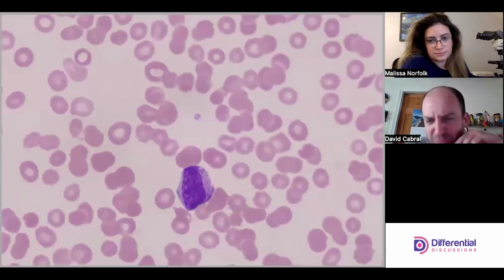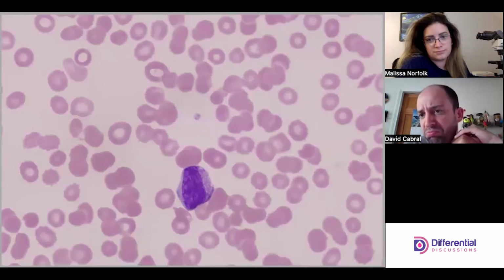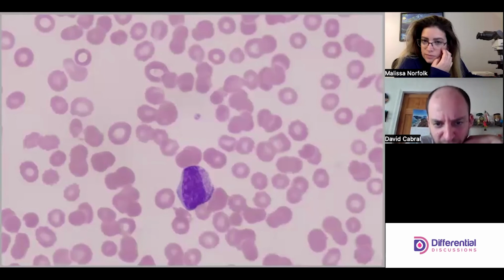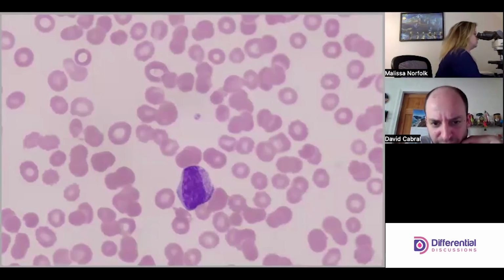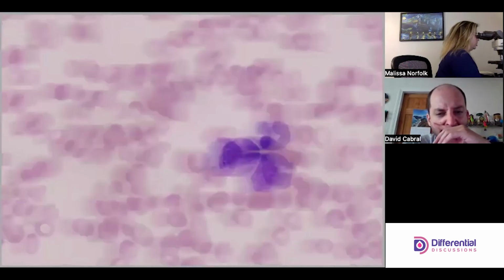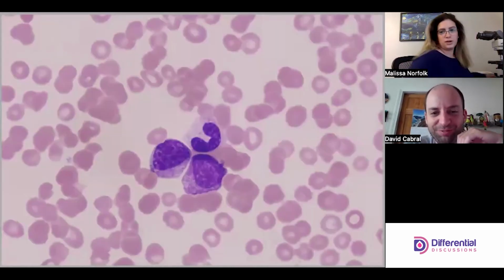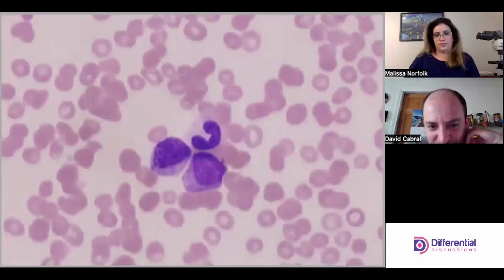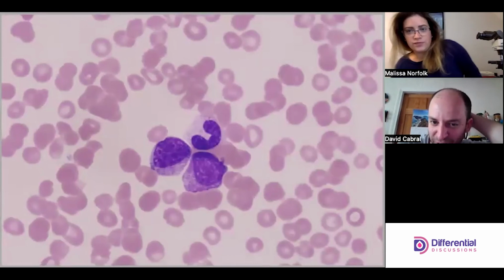Pro? Yeah. The granules are not as prominent as the other pros. Yep, I agree. Oh yes. Cool. All right. Why don't we end with this group here? Sure. Yeah, it sounds like a good spot to be.